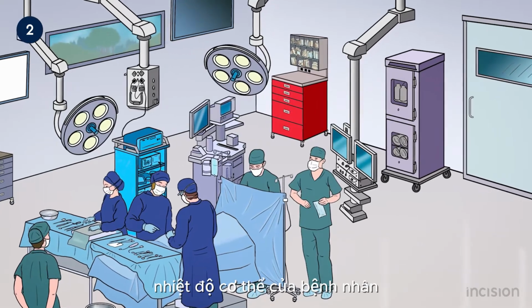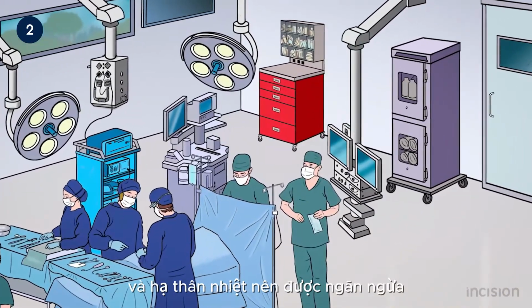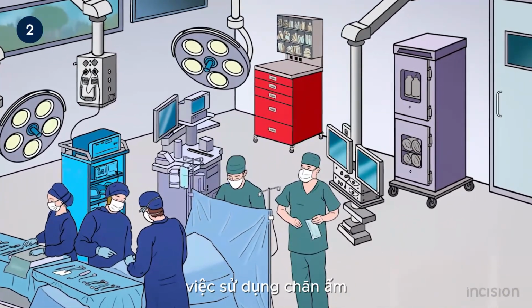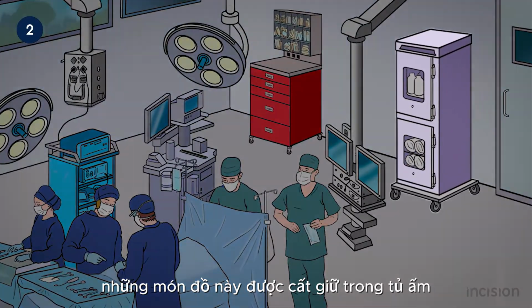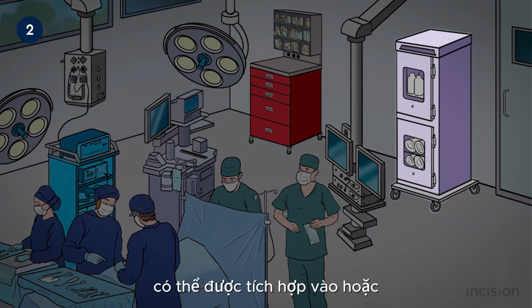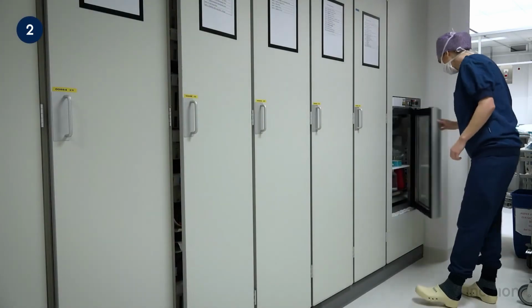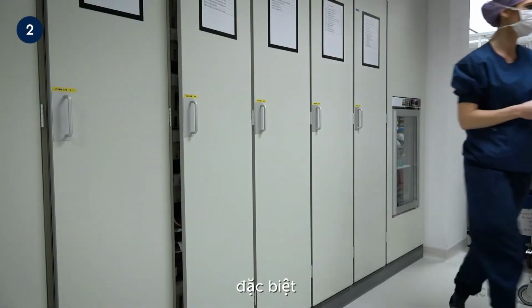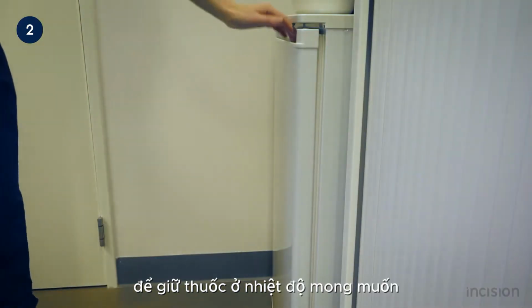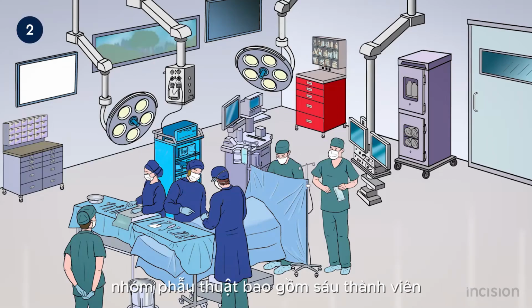The body temperature of the patient should be kept stable and hypothermia should be prevented. The use of warmed blankets and fluids during long procedures is advised. These items are stored in a warmed closet, which may be integrated into the OR, or outside near the OR. A refrigerator is used in the operating room complex, especially for keeping medicines at the desired temperature, or to preserve specimens.